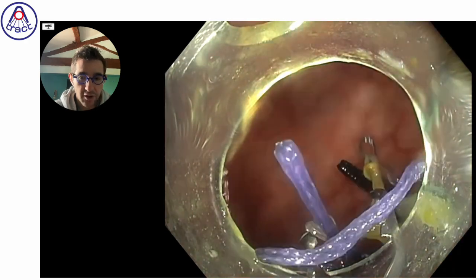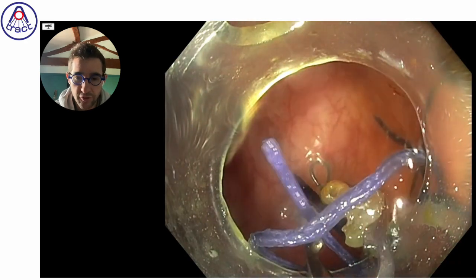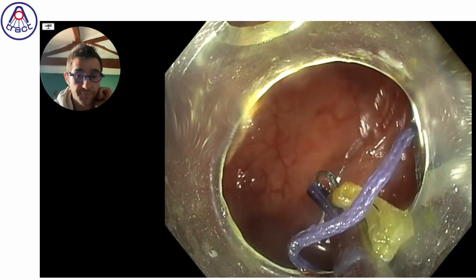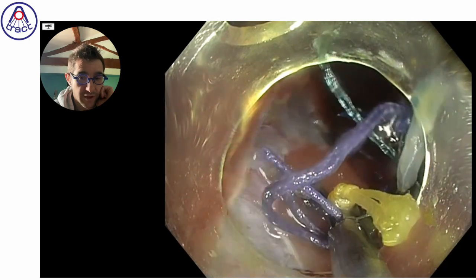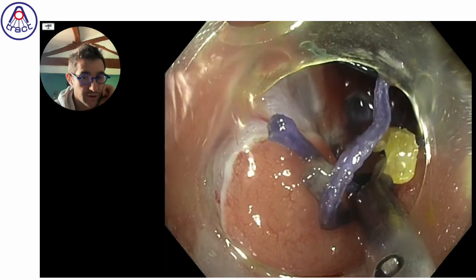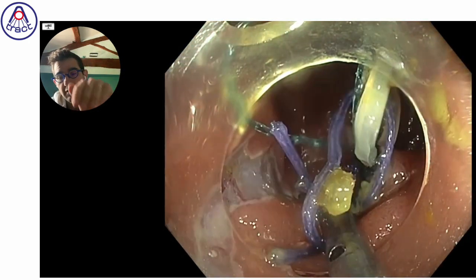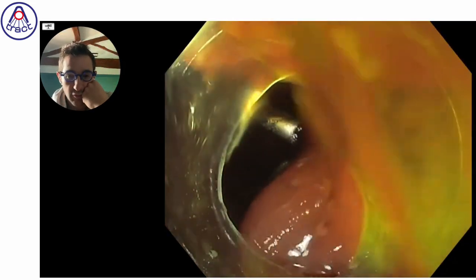And finally, the yellow loop, not the yellow, but the purple loop was in front of me, a little avoiding a good view, but finally I could catch the good loop, the purple one, and fix it on the left edge and a little on the cecal side in order to improve it.